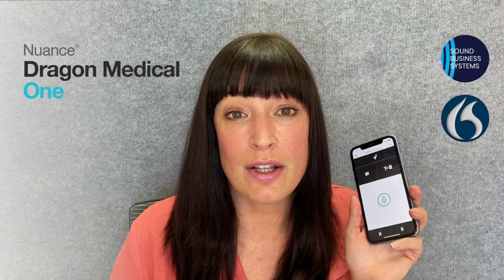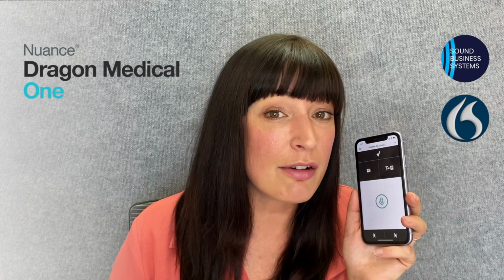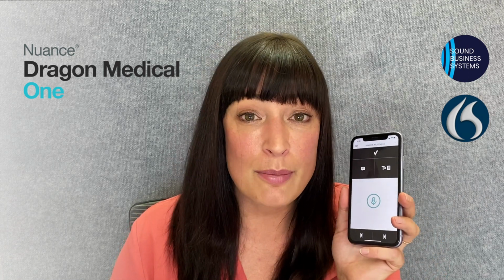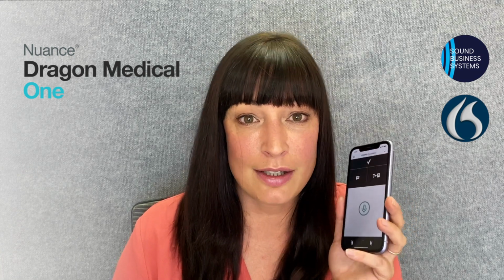I'm also using the Power Mic mobile app. This acts like a microphone and allows me to speak live to my PC. It also has some nice hot buttons on it which allow me to use my Dragon better. I'll show you a couple of things now.